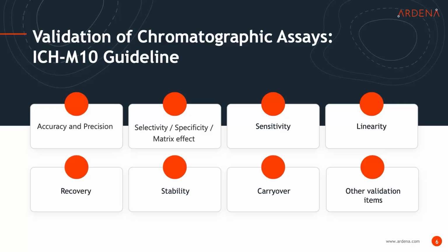Under the ICH M10, there are three types of validation. A full validation, where all the items I just discussed need to be validated.